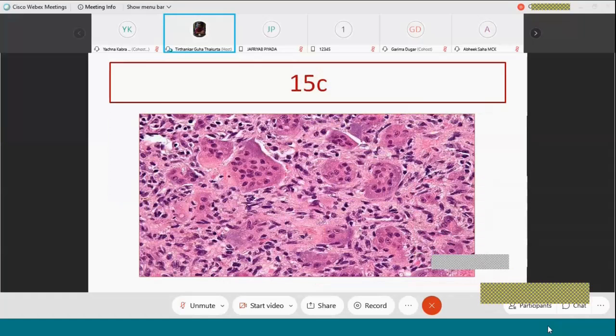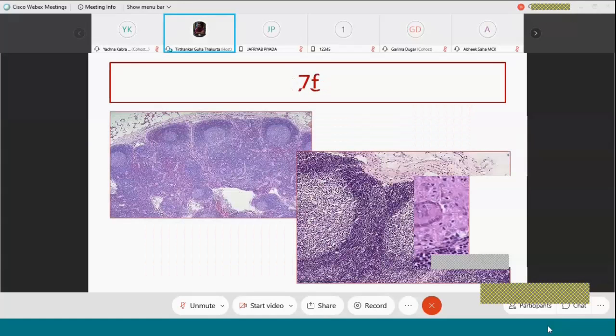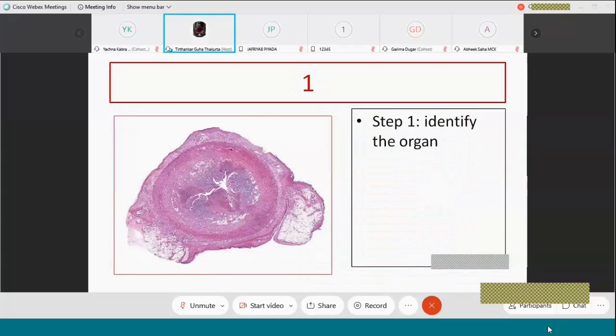By now you know what are the topics that are in your syllabus, and I will expect you to diagnose only from the list of topics in your syllabus. That will make your job much easier. Fine. So let us start. So what is your diagnosis here?